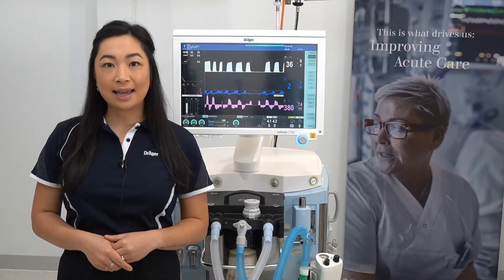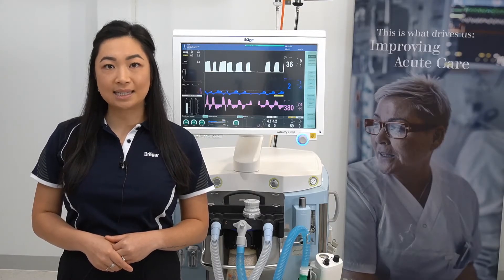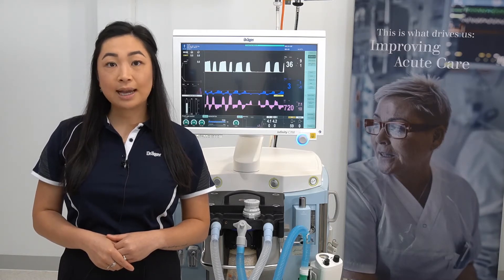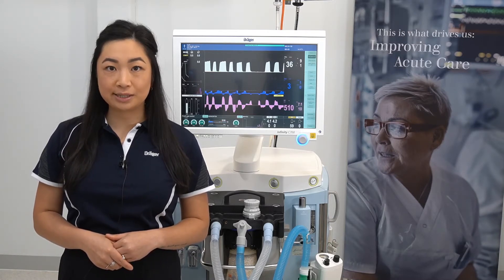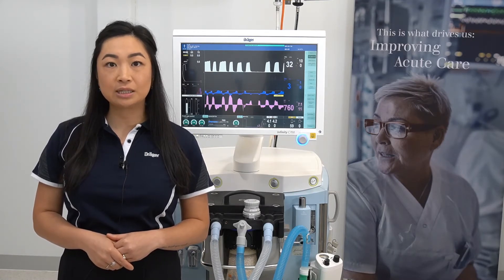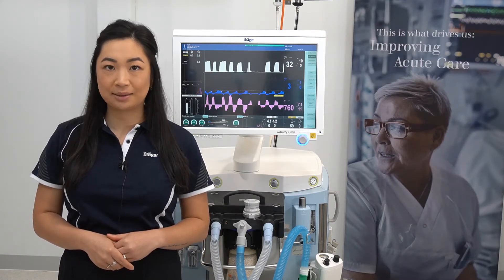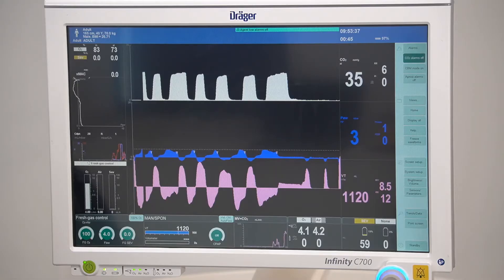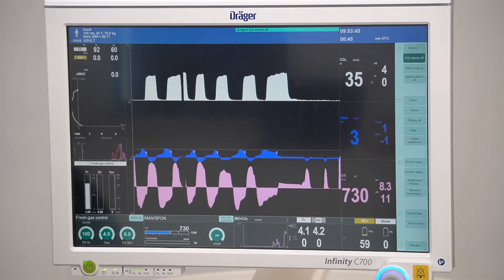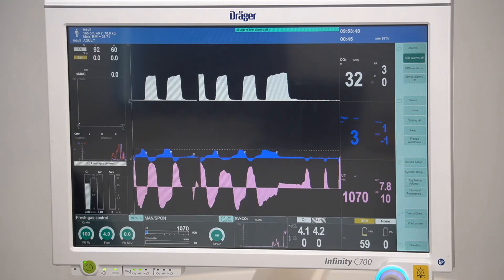In Zeus IE, the ventilator is always active in manned spont mode. This creates a circular flow which reduces the inspiratory resistance, making it easier for patients to breathe completely spontaneously. If you want the patient to breathe spontaneously on a certain pressure level to hold the lung open, CPAP can be applied. This also increases the functional residual capacity of the lung.